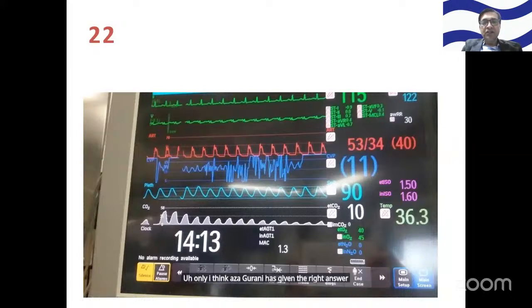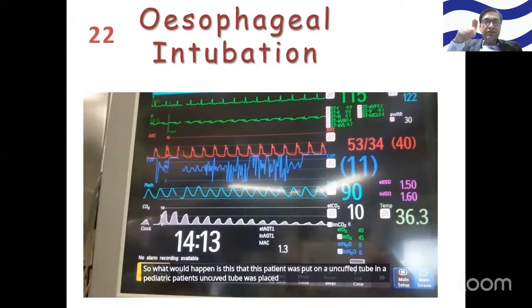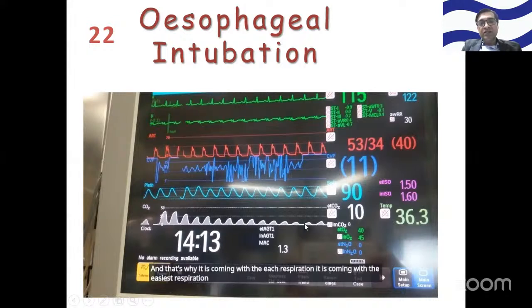It's an esophageal intubation. What would have happened is that this pediatric patient was put on an uncuffed tube, and while we were fixing or ventilating, the tube would have slipped into the esophagus, and that's why it is coming with each respiration. Now, where is this CO2 coming from?